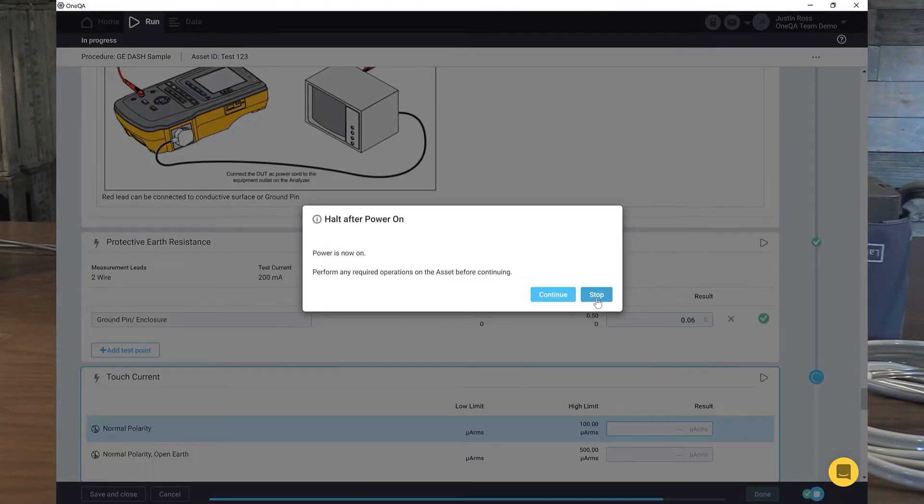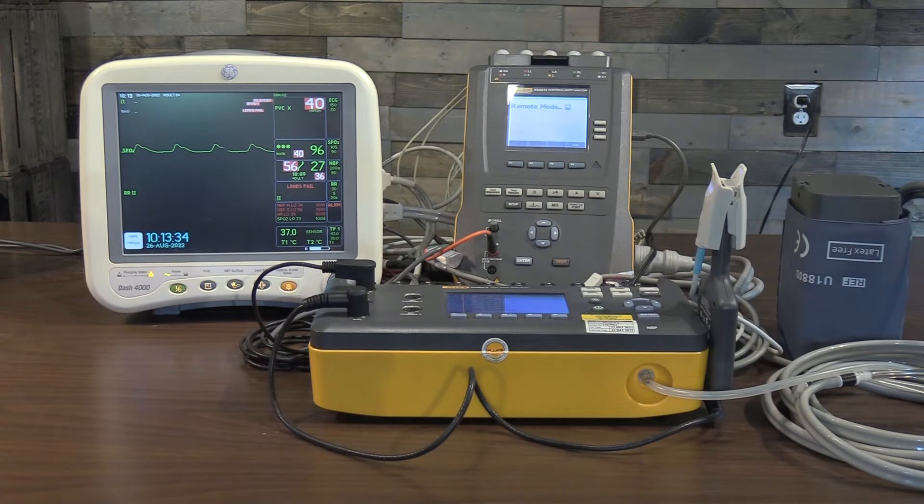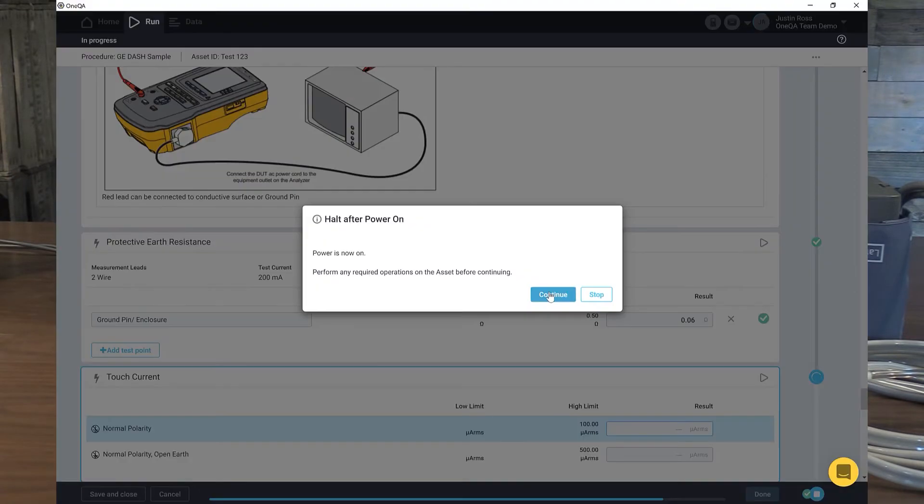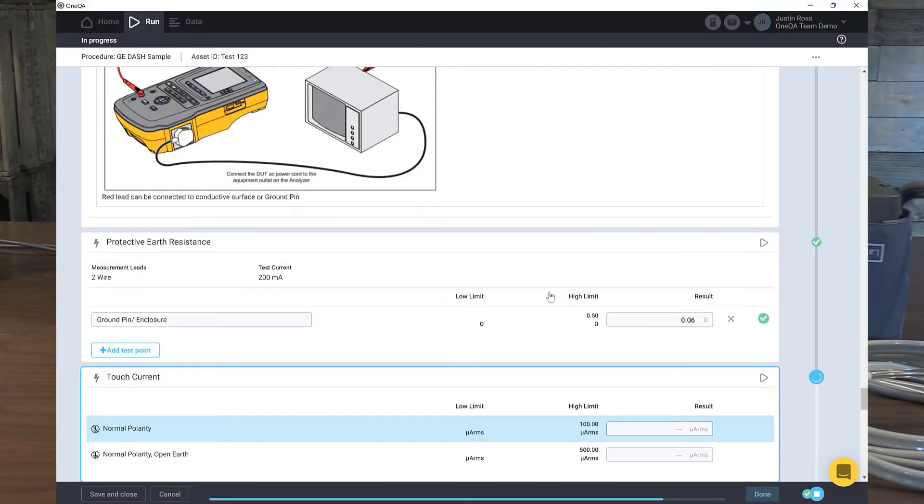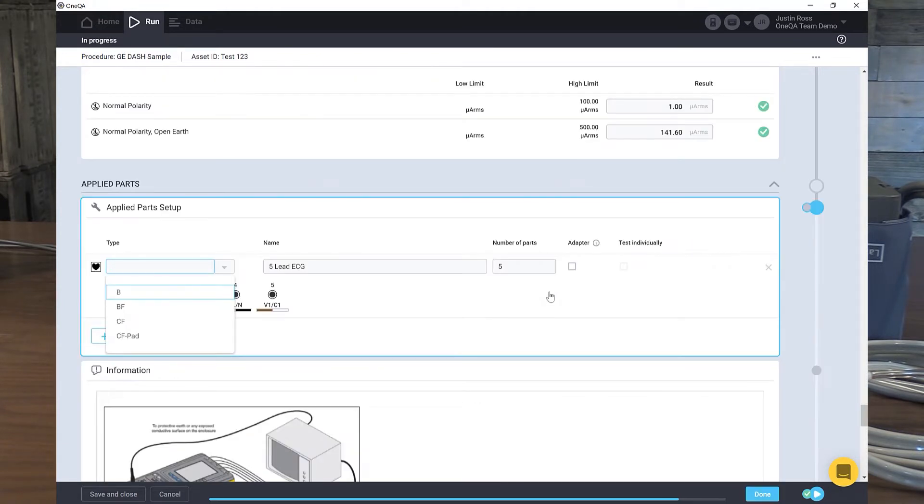Again, I'm not pushing any buttons on the electrical safety analyzer. I'm not adjusting anything. I'm simply hitting run and making sure it's powered on. All the results are automatically populated. We have passes there.